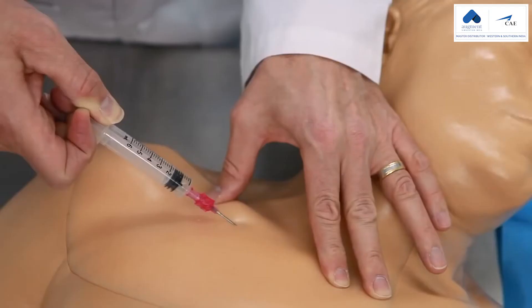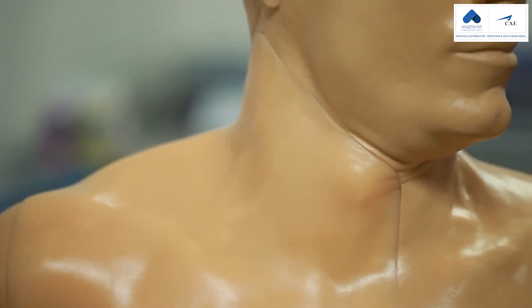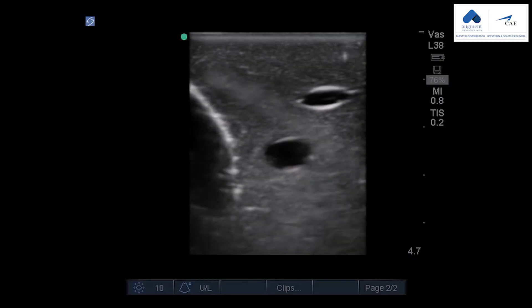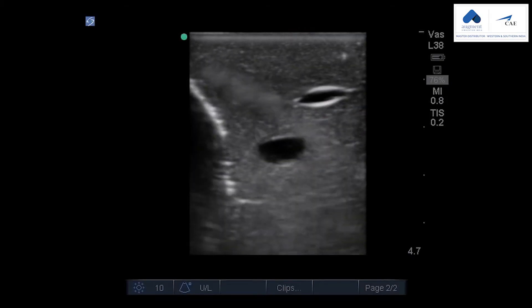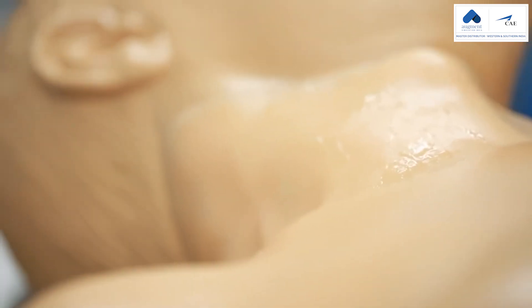Whether you're targeting the IJ, subclavian, and axillary vessels, or the brachial plexus, we give you the anatomy you need. The veins are compressible in order to identify the targeted vessels. And we've added the trachea to offer as an internal landmark.